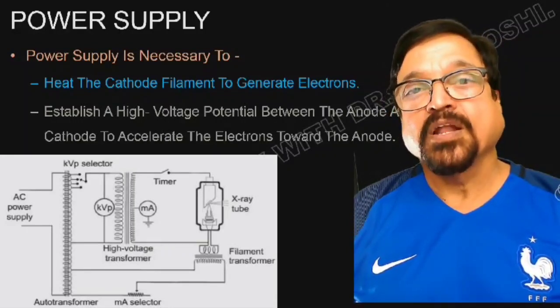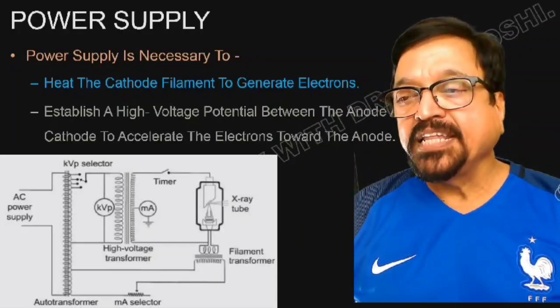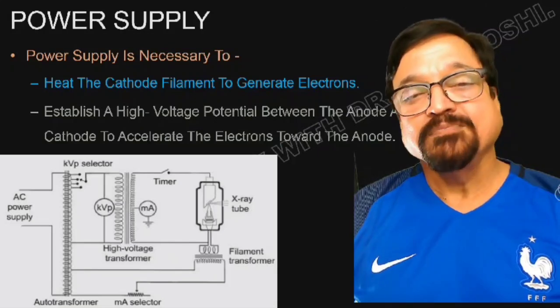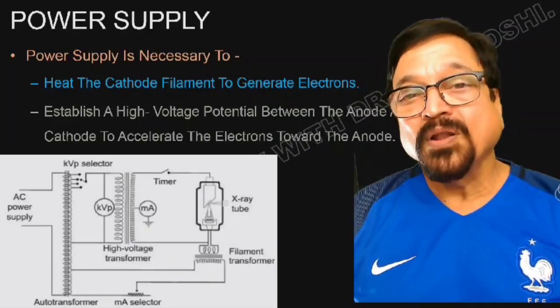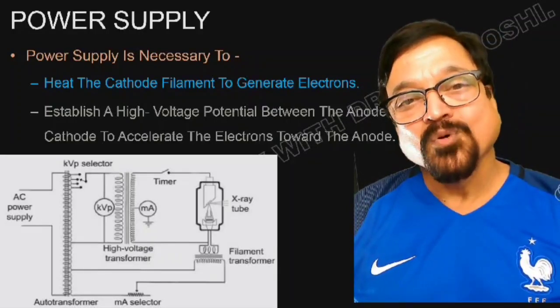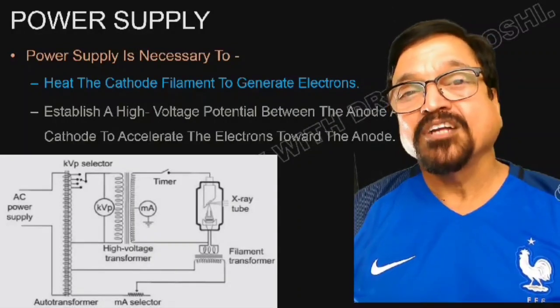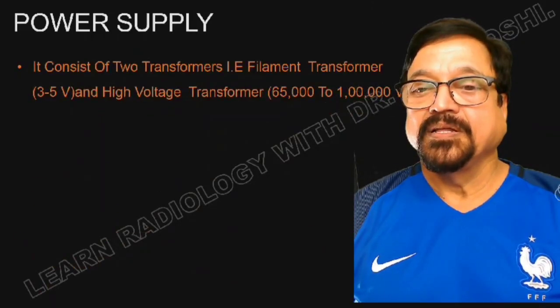Now what does the power supply do? It heats the cathode filament to generate electrons. An electron cloud is generated by them, and a high voltage potential is established between the anode and cathode to accelerate them. So once there is a difference between anode and cathode, there will be more and more acceleration, and more acceleration results in more X-ray production, or better kVs. Large-capacity X-rays will be produced from them.